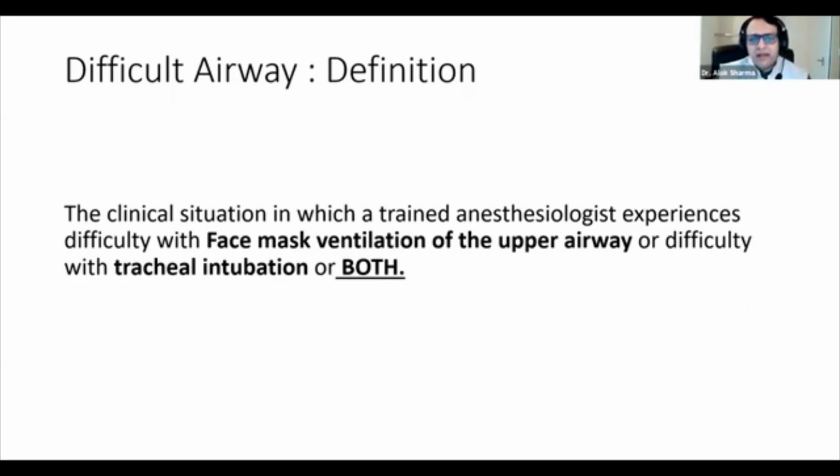Now, how do you define the difficult neonatal airway? It's not enough for us to say that if we had a baby where we could see the glottis but couldn't pass a tube in, that airway is difficult. Because if you look at the spectrum, for the expert who has a lot of experience in intubating, that failure might just be due to secretions. But for the novice learner who's intubating that baby for the first time, in his mind, that airway would be difficult. So we have to make this very objective.